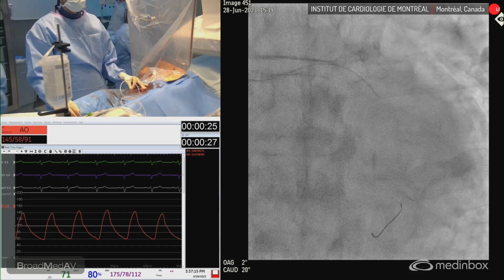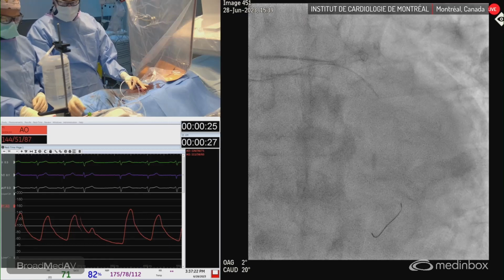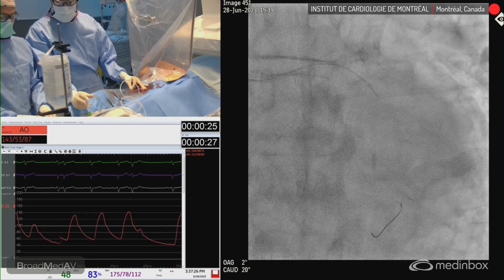All right. So do we need to do another one, or are we okay now? I think we're good. I didn't hear any tonal changes. Okay, I think we should remove this. Let's remove it. So Dynaglide, yeah, we can demonstrate that.